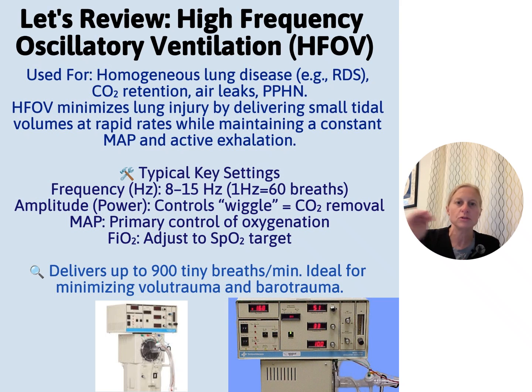Based on the drum is the speed at which that's happening, so it can sound very fast or slowed down, but the oscillator has such a unique sound. It's pushing air in and pulling air out, so it has an active exhalation phase, which makes the high frequency oscillating ventilator, HFOV, unique.